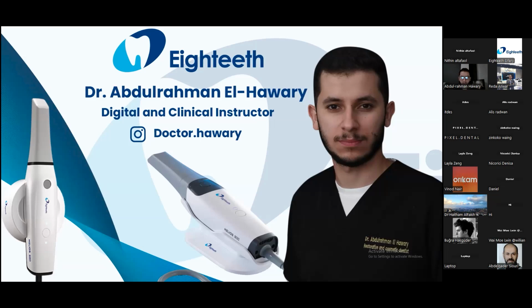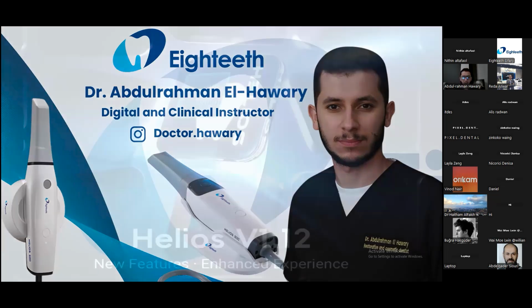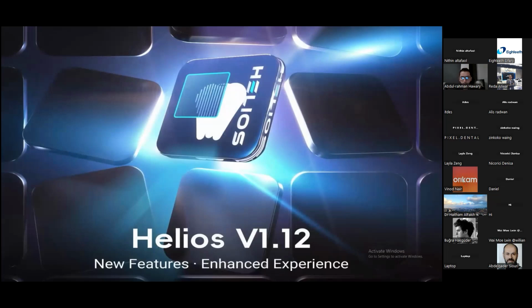So first of all, I'd like to introduce myself. My name is Dr. Abdulrahman El-Hawary. I'm the digital and clinical instructor for Eighteeth Medical. So we will be unveiling the new software for the Helios, which is the V1.12.